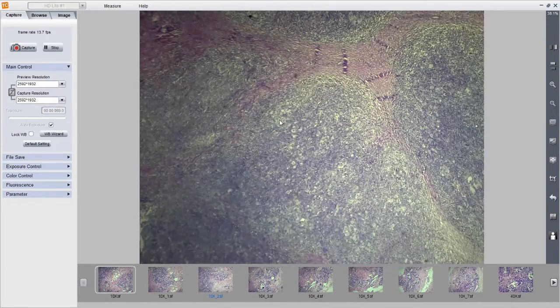What are these cells? Something is standing out. These cells are standing out within these nodules, very clearly. Now the background is some lymphoid tissue, at least in this power, and we are seeing some large cells standing out.